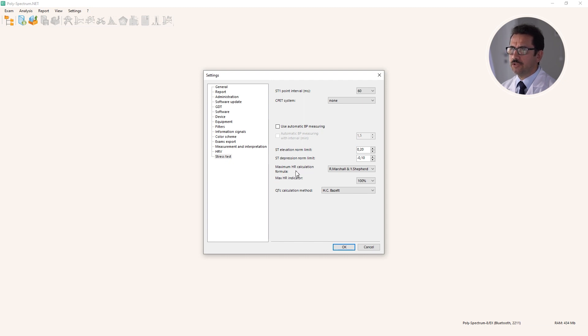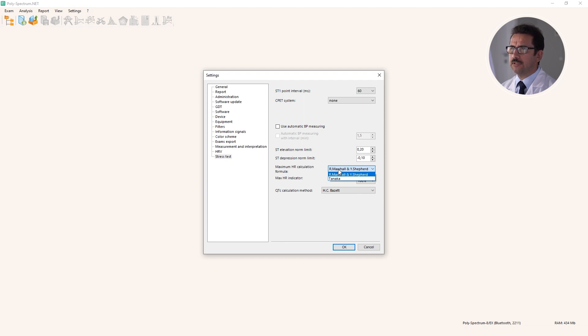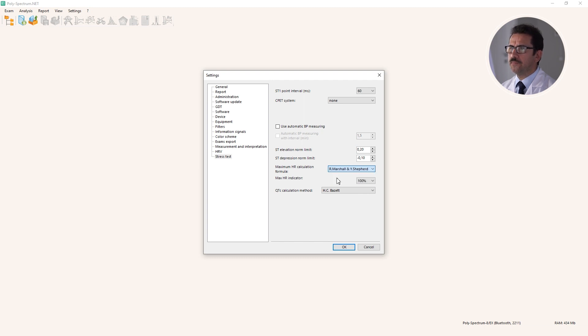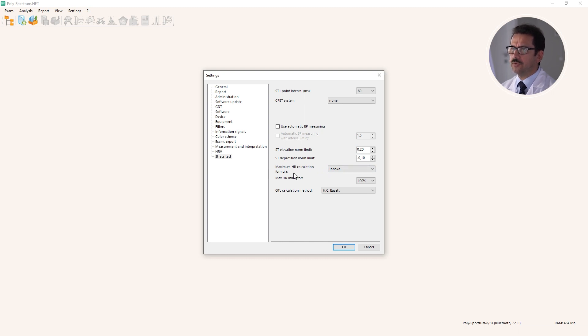Maximal heart rate calculation formula. More than 30 different formulas exist, but most practical are 220 minus age (that's Marshall) and Tanaka equation. Me personally, and some other experts, prefer Tanaka, so you can select one.